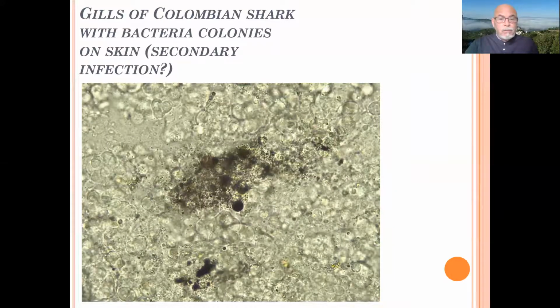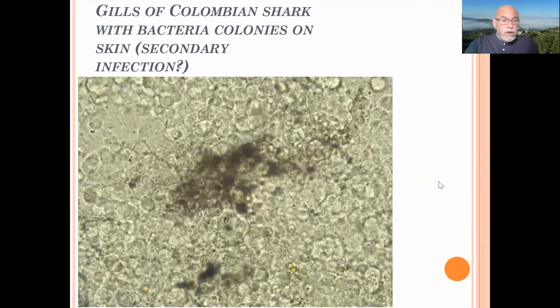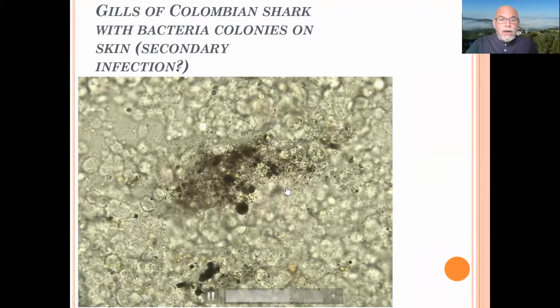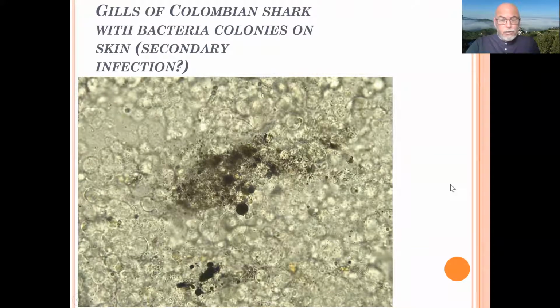Also on the skin, we found colonies of bacteria, all those black balls here. Those are thousands of bacteria, spheres of bacteria. So this could also be the cause of a secondary bacterial infection. And this is something you have to worry about, and you might see him moving around, trembling on the spot. Hard to see. You need a special high definition microscope for that, and it's not so important for us to see what kind of bacteria. You will know.